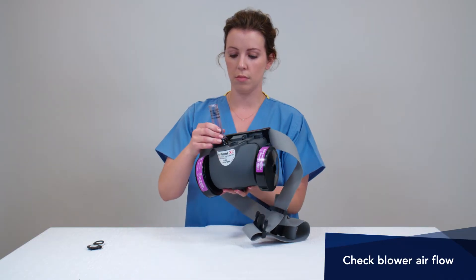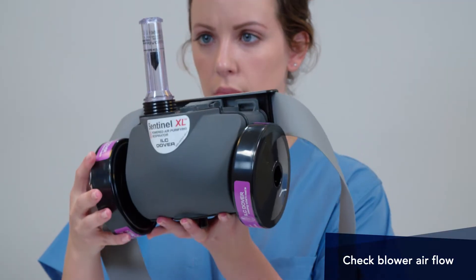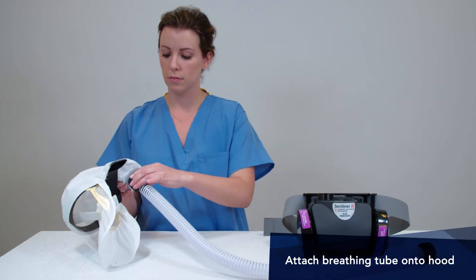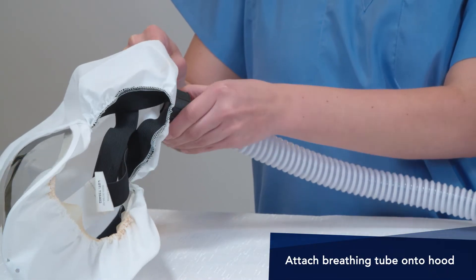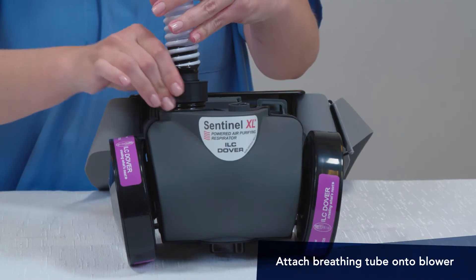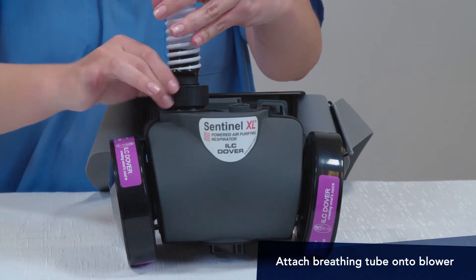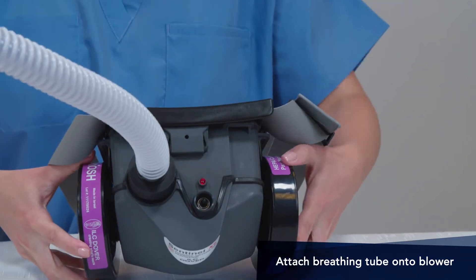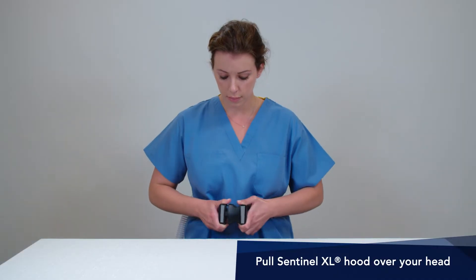Confirm the airflow rate by using the flow meter included with your kit. Attach the breathing tube by threading it onto the hood and then onto the blower assembly. Secure the blower around your waist.